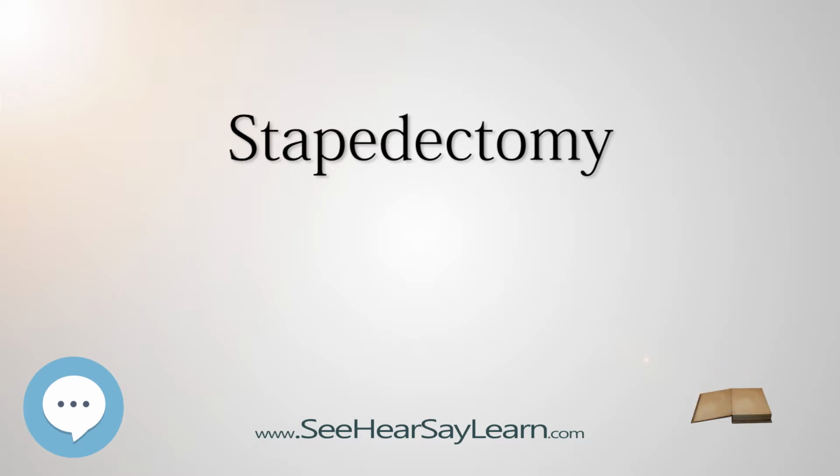Laser stapedotomy is a well-established surgical technique for treating conductive hearing loss due to otosclerosis. The procedure creates a tiny opening in the stapes, the smallest bone in the human body, in which to secure a prosthetic. The CO2 laser allows the surgeon to create very small, precisely placed holes without increasing the temperature of the inner ear fluid by more than 1 degree, making this an extremely safe surgical solution. The hole diameter can be predetermined according to the prosthesis diameter. Treatment can be completed in a single operation visit using anesthesia, normally followed by 1 or 2 nights hospitalization with subsequent at-home recovery time a matter of days or weeks.